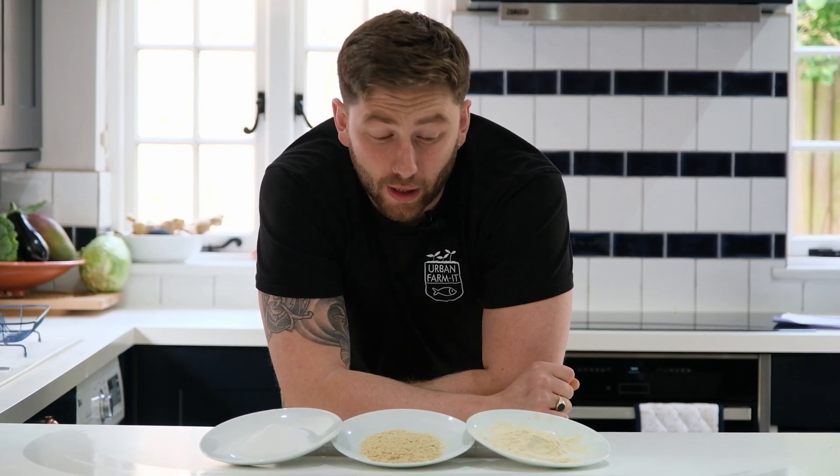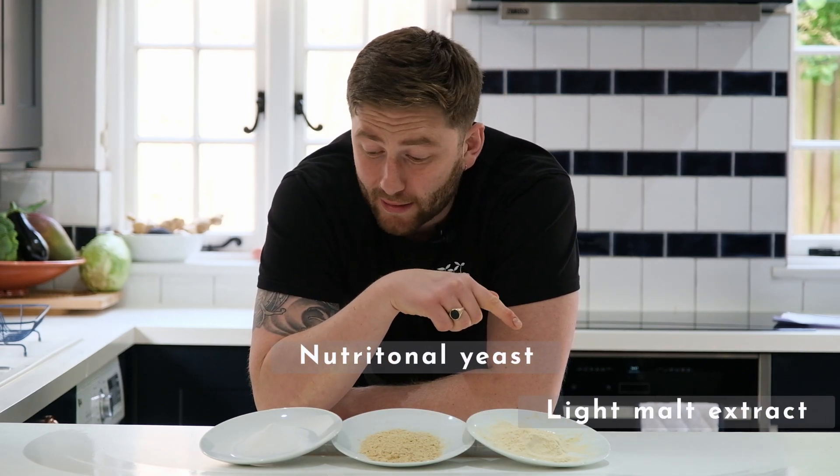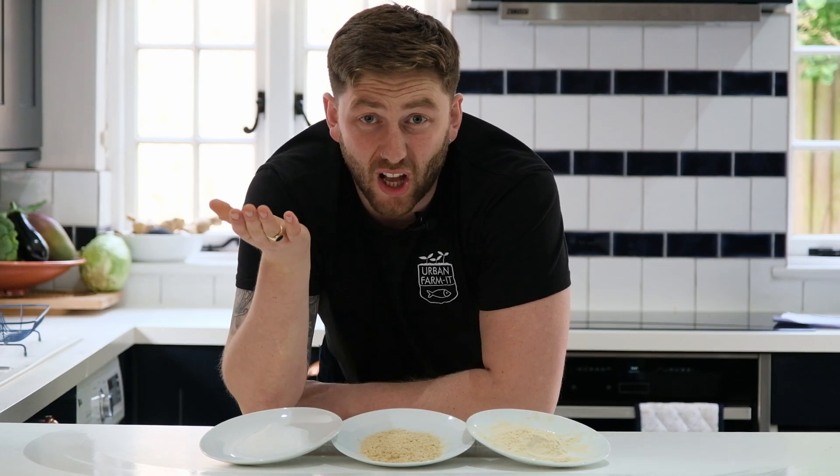The liquid part of liquid culture is essentially just a nutrient broth, and normally very high energy, containing lots of sugar. Some of the most common ingredients that you might use in your liquid culture blend are nutritional yeast, light malt extract, and dextrose. However, there's a host of other ingredients you could use too, such as honey.